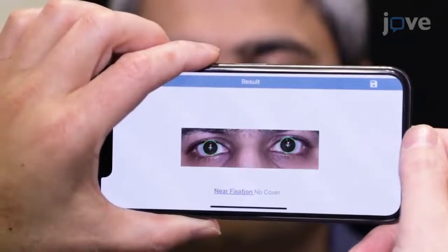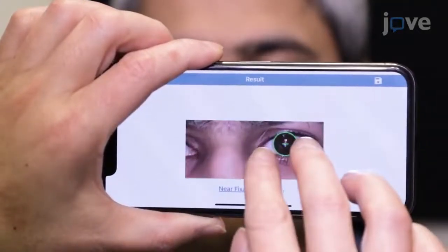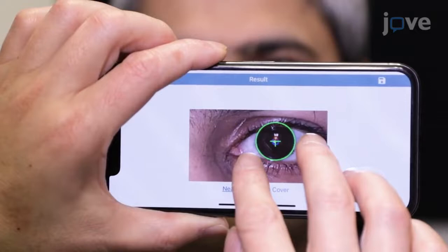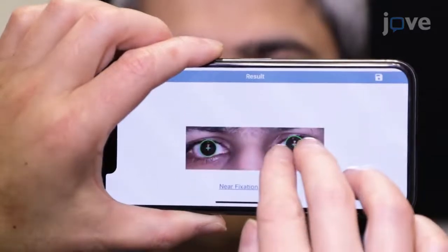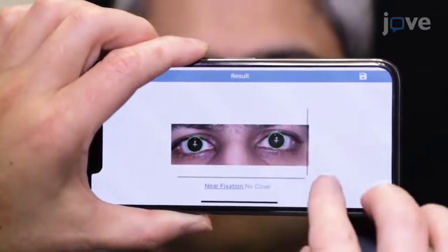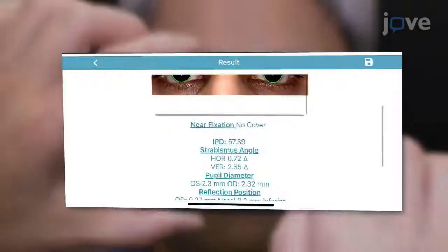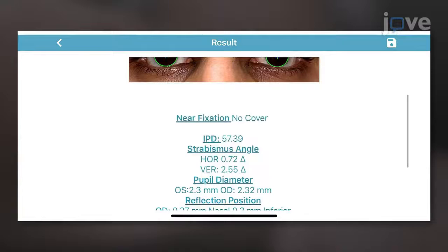When the analysis is complete, the app will show the detected limbus boundary, the center of the eye, and the location of the corneal reflection. After verifying that these features have been detected without obvious errors, observe the measurements related to the eye alignment.